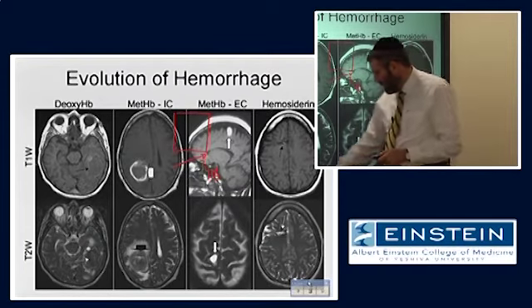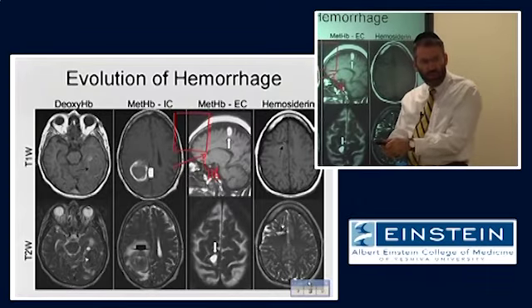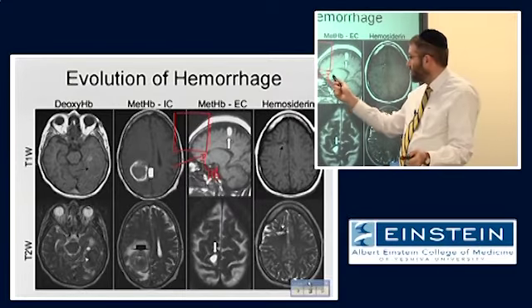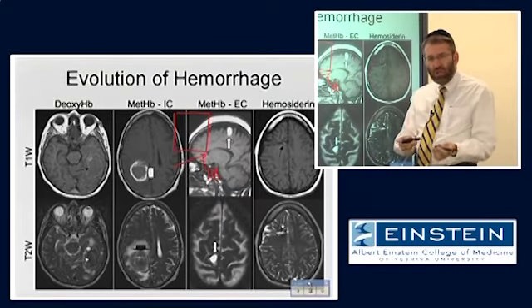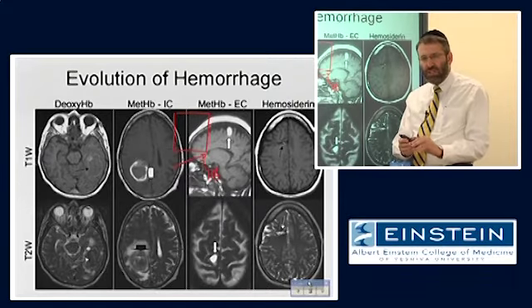Well, what we expect then is that if we have our magnetization generate signal, there will be some dephasing based on the fact that some of these spins are in areas with higher field strength and some in areas with lower field strength. And we expect that the 180-degree RF pulse should generate a spin echo and refocus that magnetization. That's based on an assumption.